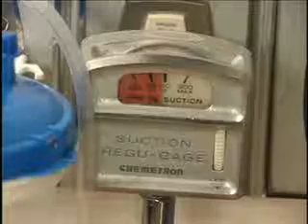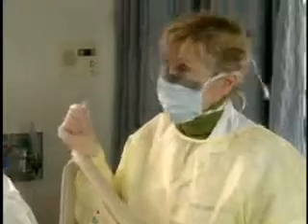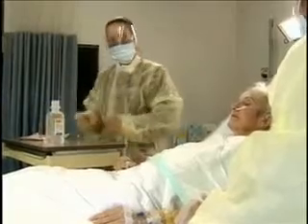Now we're looking good over here. The suction is on at 100 to 120 millimeters mercury of pressure since she's an adult. Okay. This is where I need some help. Sure, Anna. Well, the suction's on, so open the saline and then open the sterile suction catheter package and put on the sterile gloves.